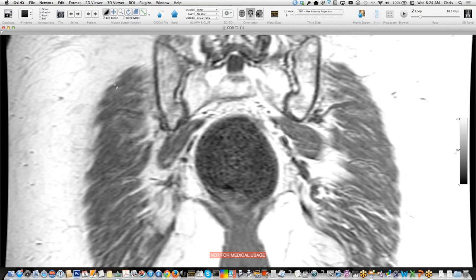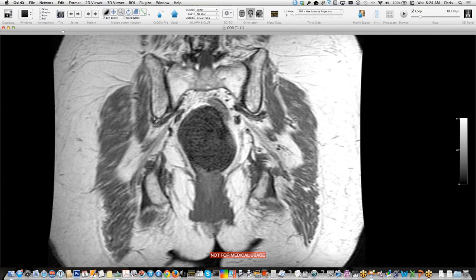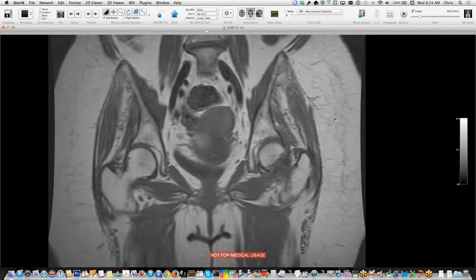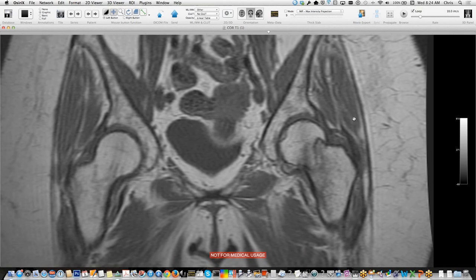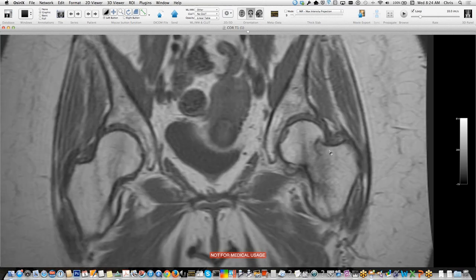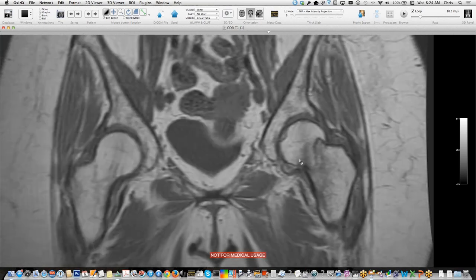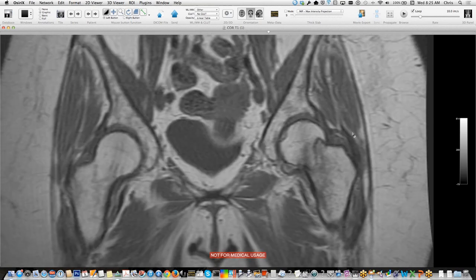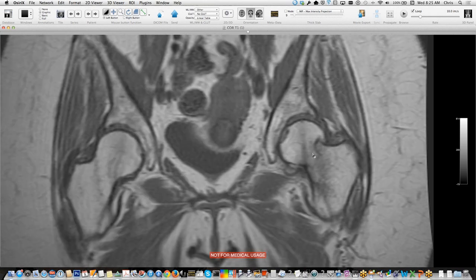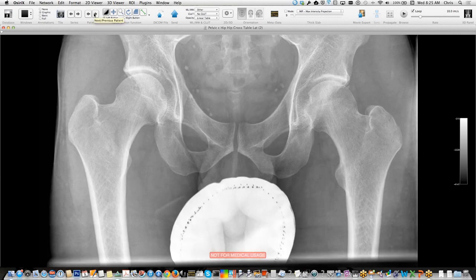The MR from that patient shows a coronal T1-weighted image with normal white marrow fat. There's a low signal line in the mid-femoral neck — the fracture line — more impacted laterally than medially, with surrounding low signal from bone edema. MR confirms the fracture goes all the way across the femoral neck, making it a surgical fracture. These days, these get pinned. MR is helpful for confirming fractures and ensuring they go completely across, which determines surgical versus non-surgical management.